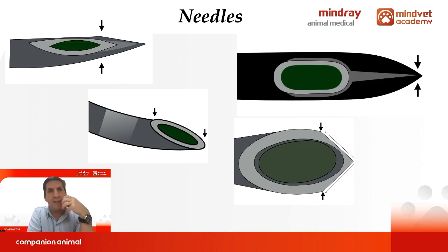Perhaps you know that there are a lot of companies producing different kinds of needles, and every single needle, that means every single size, every single length, every single tip, is developed to perform different techniques. For instance, hypodermic needles are developed to pierce and pass through tissues without resistance.